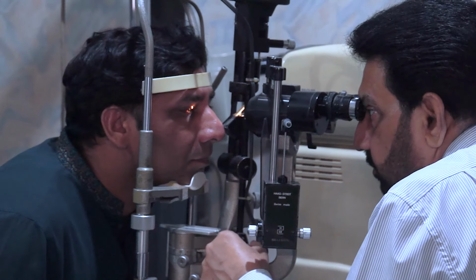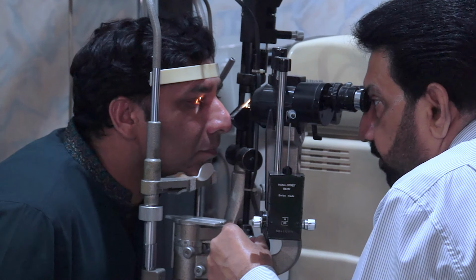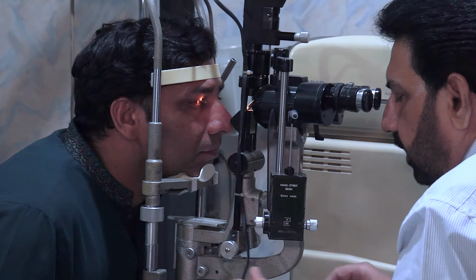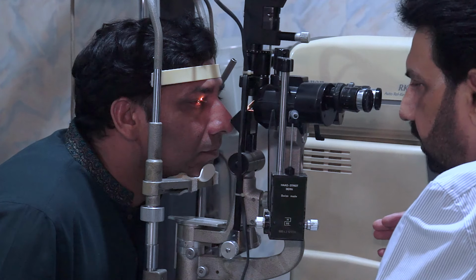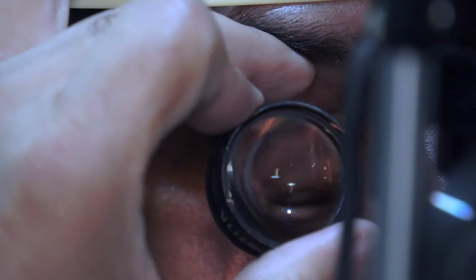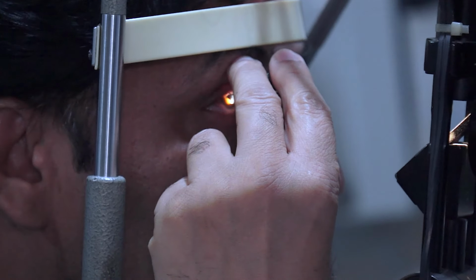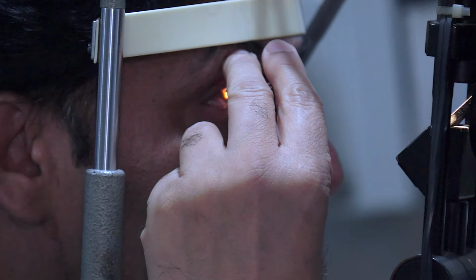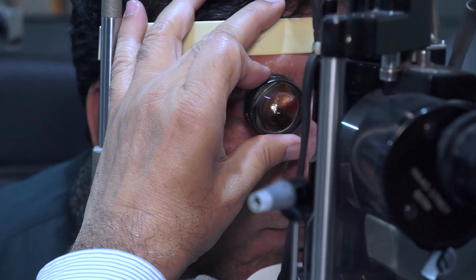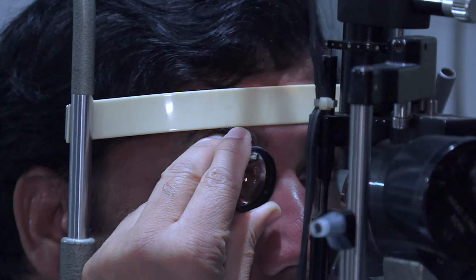With additional lenses, we can even examine the fundus or the retina and the vitreous opacities, vitreous abnormalities with a high powered lens, either a 78 or 90 or sometimes 60 diopter lens, in which case we ask the patient to keep the eyes widely open, and we dilate the pupil with the mydriatics, and then we bring the lens in front of the cornea, and through the pupil we can examine the fundus and the vitreous, that means the retina and the vitreous of the patient with the 78 diopter lens.